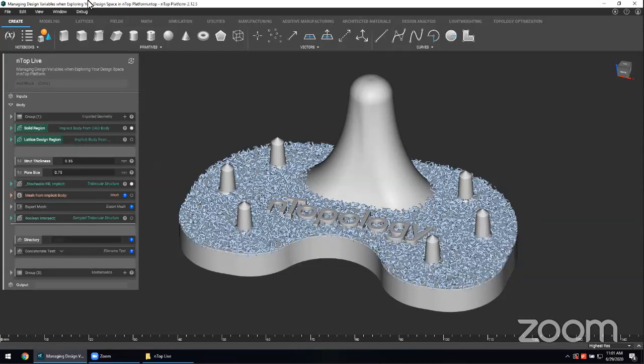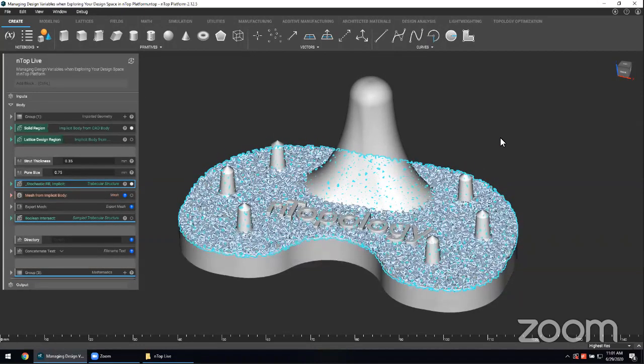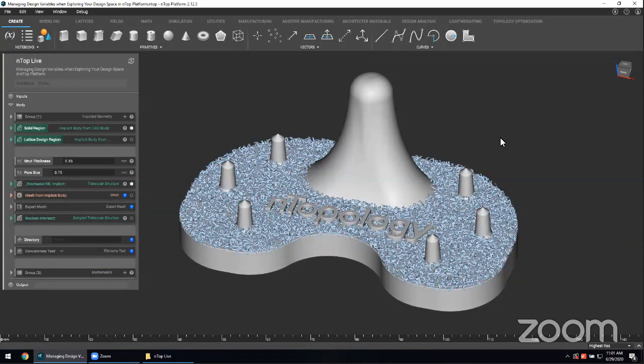What we have here is a workflow that already has a generated result on an orthopedic implant, which is an osteo integrative lattice on this tibial tray. In non-medical terms, this is a randomized lattice structure that has been generated on the surface region of just this part. And this part is one of the critical and printable components in a total knee replacement surgery.